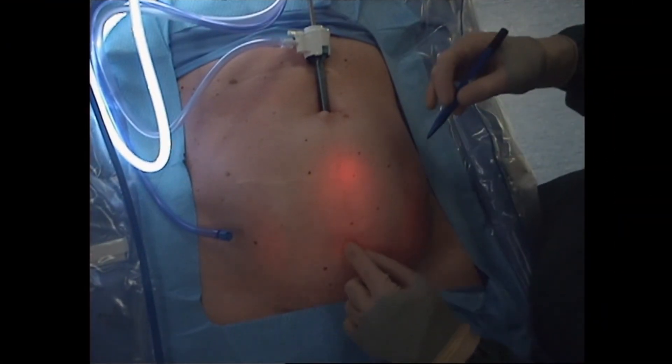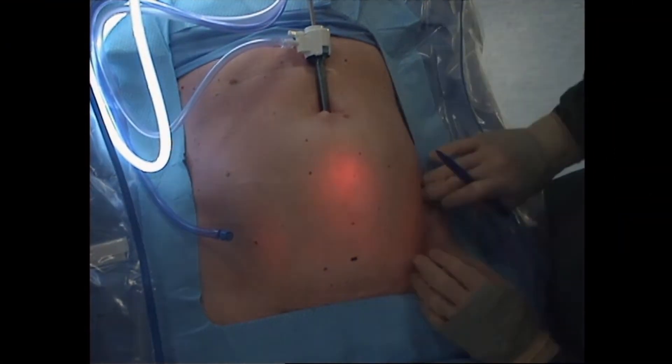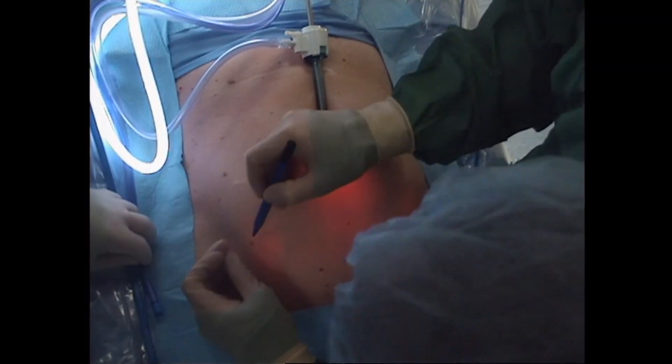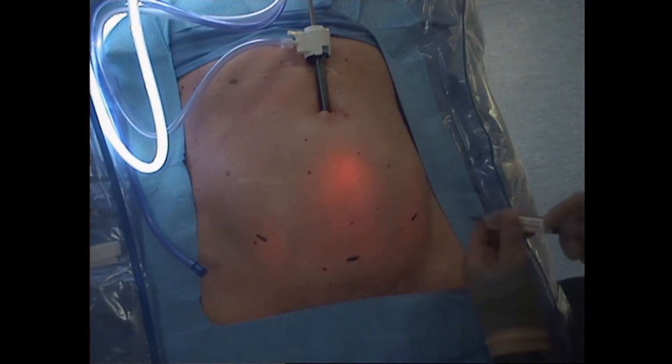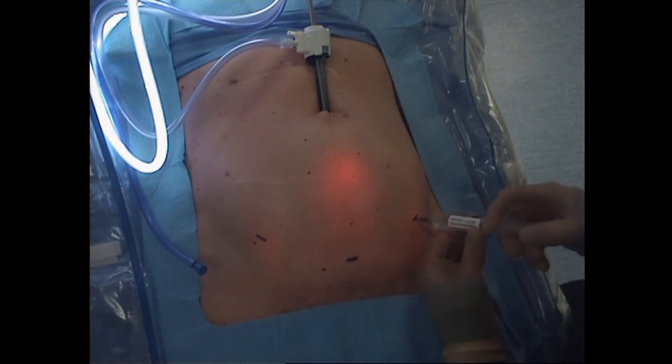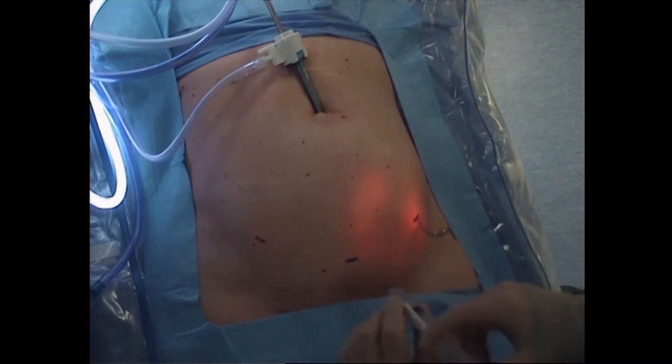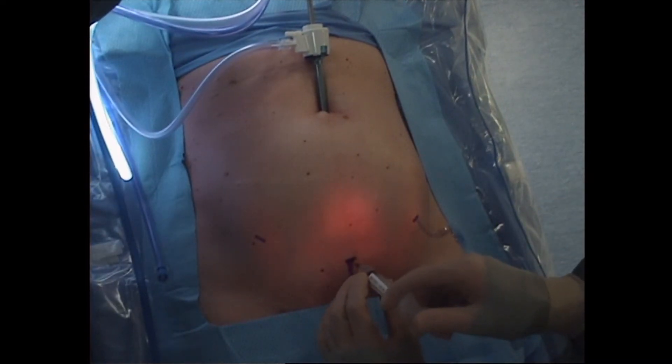I then make the marks in the bikini line, starting in the suprapubic region and then in the right lower quadrant and left lower quadrant, placing the marks medial to the anterior superior iliac spines. 0.5% bupivacaine is injected into each mark, with internal verification that there is a wheal within the peritoneum and its lining.